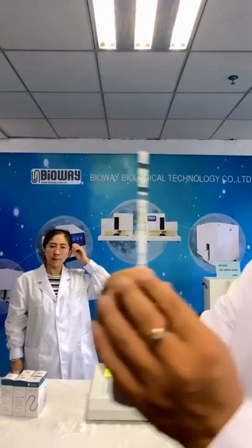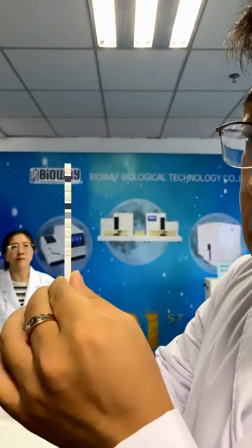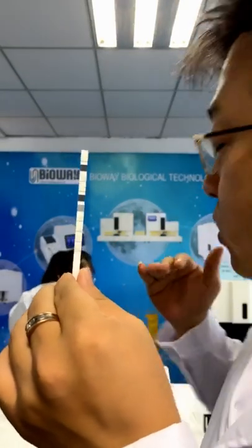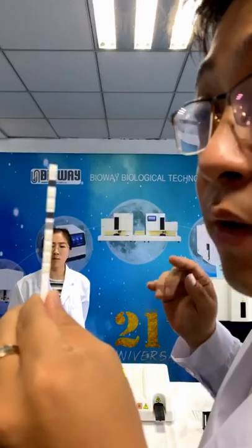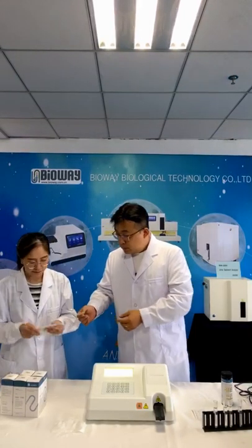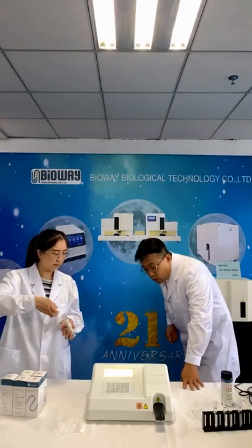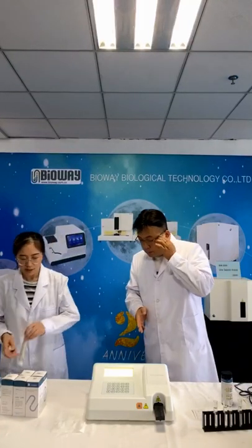We can see that the calibration strip is similar to the BW300. All the same. The function is the same, the strips are the same, the result is the same. So when you start to use these machines, it can also help you to calibrate first. And I found this machine includes two different parts in the back.